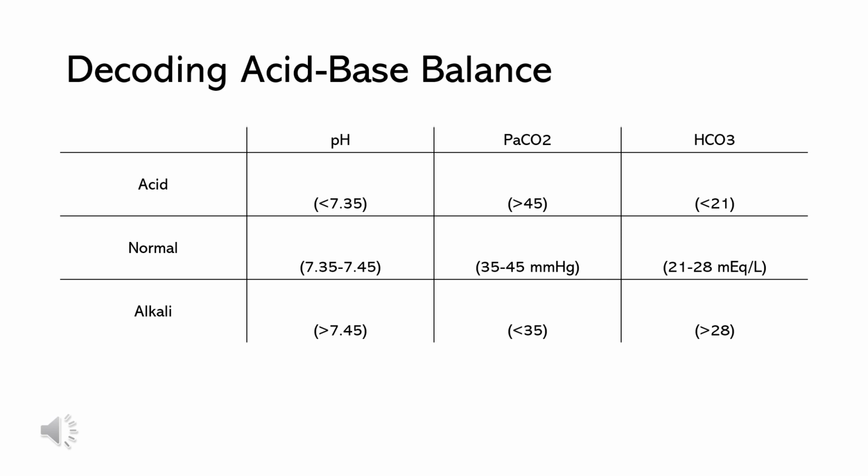Then check the third value in your tic-tac-toe grid, the one that did not align with the first two. If this value moves in the opposite direction of the pH, then compensation is occurring. Recognizing compensation is critical for understanding the severity and for planning further care.